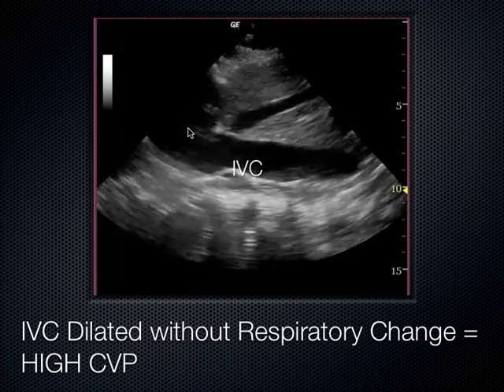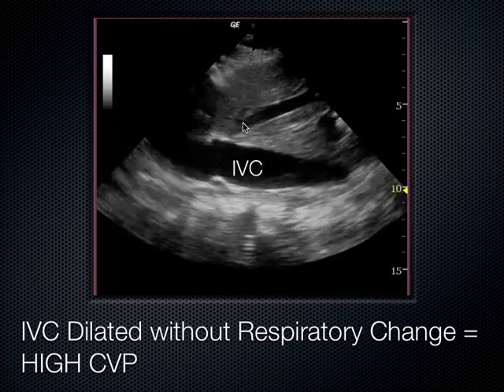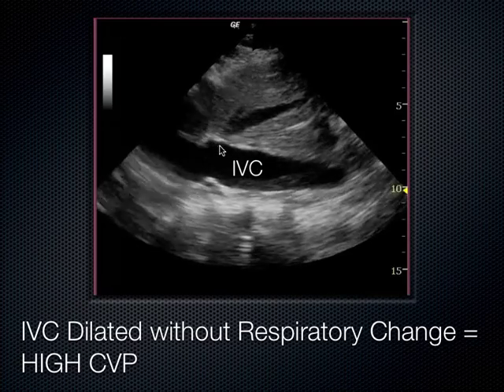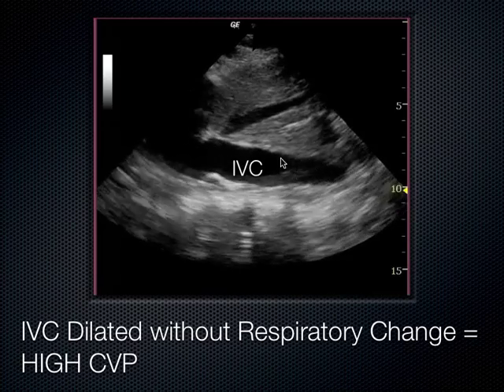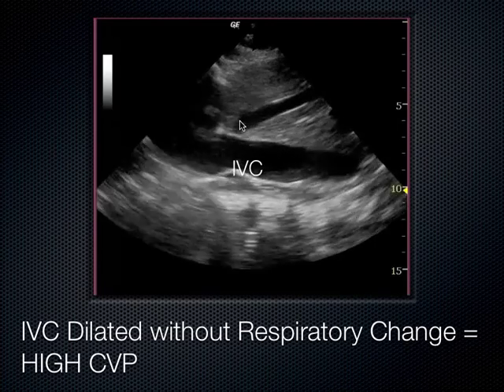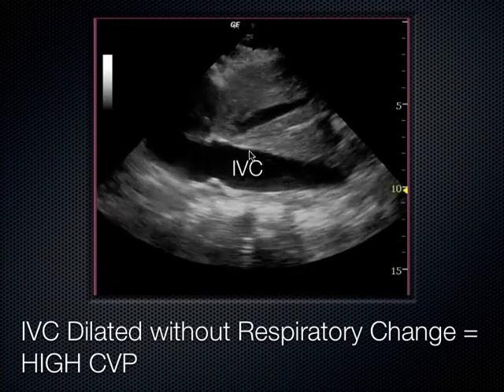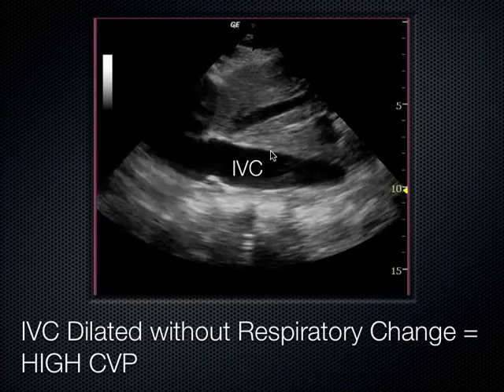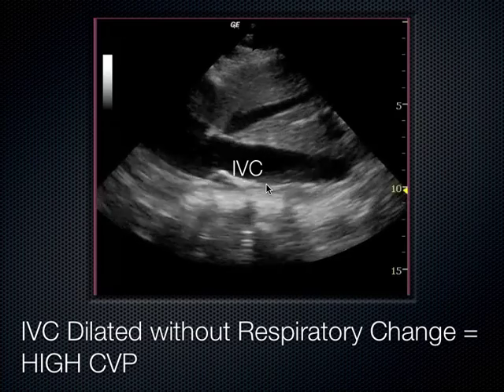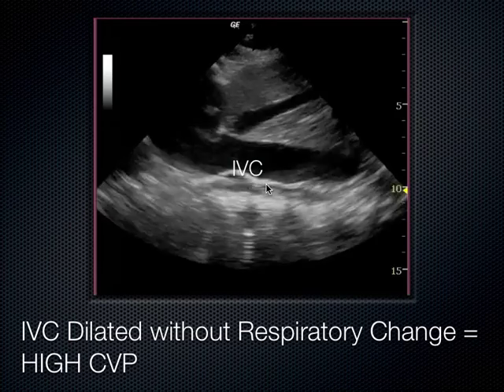This is the heart right here. This is the right atrium of the heart. Here's the IVC coming across the screen underneath the liver. This is the hepatic vein right here. People always say, where do I measure the IVC? Over here, over here, over here. It's a hotly debated topic. Probably 2 centimeters distal to where the hepatic vein dumps into the IVC. That would be around here, where most people agree to measure the IVC diameter. I'm just throwing this out there. It's going to come up over and over again, and I want you to be aware of it and how powerful it can be.